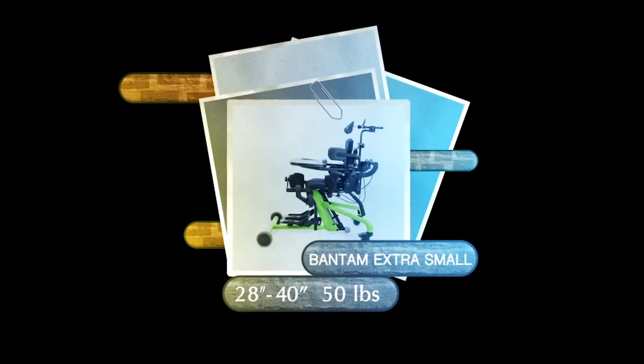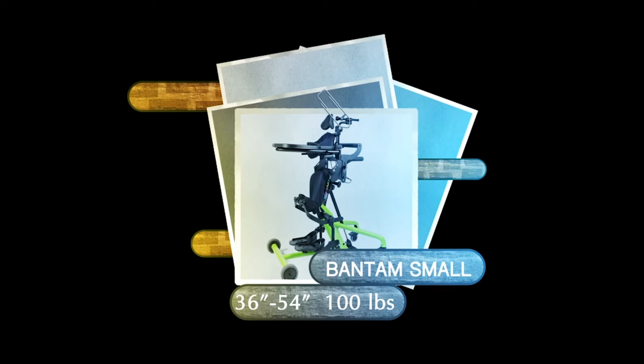Height and weight guidelines for the Bantam Extra Small is 28 inches to 40 inches tall and up to 50 pounds. The Bantam Small fits kids 36 inches to 54 inches tall and up to 100 pounds. And now the six steps for a perfect fit.